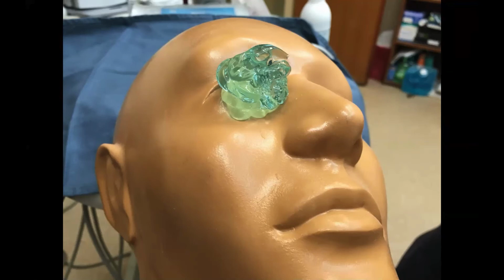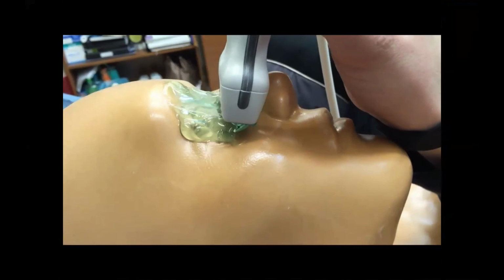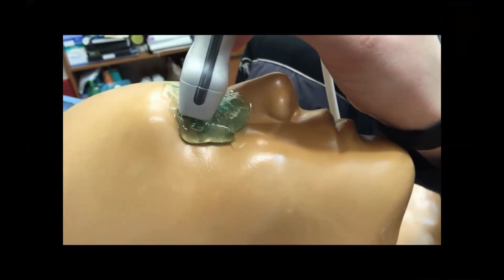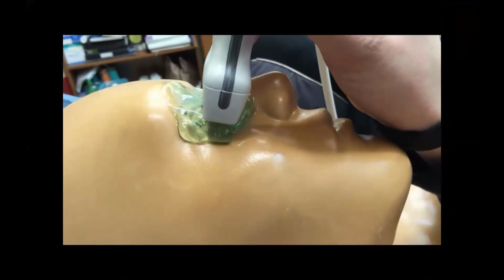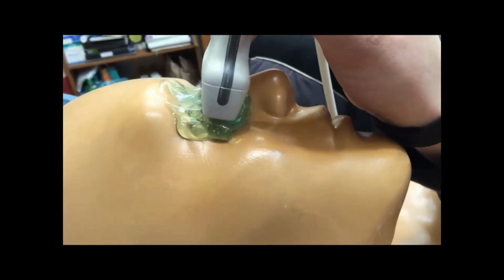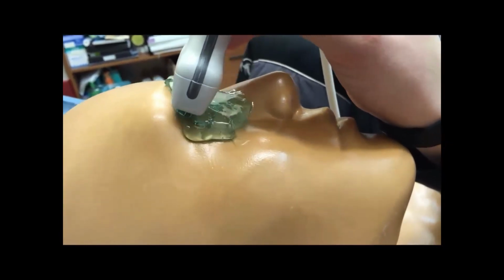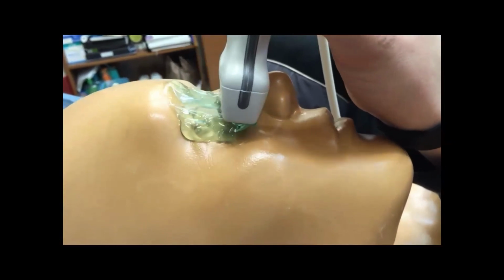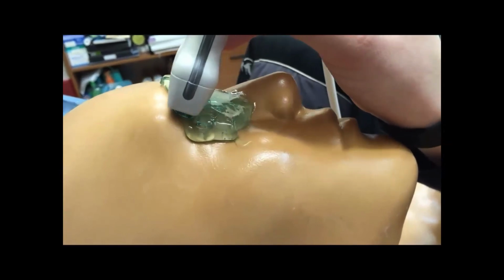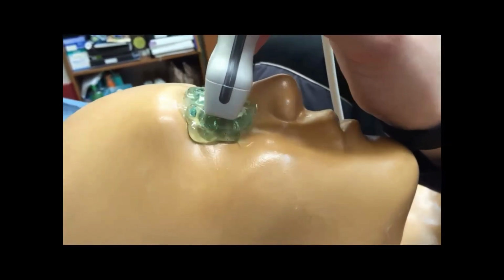Now, as you're scanning in either transverse or sagittal orientation, you're going to want to sweep through the entire eye. This is the benefit of ultrasound, that we can look in a very comprehensive manner throughout the entire eye, as well as, what we'll see in just a minute, have them move their eye. So in sagittal orientation, you put it down, you find your landmarks, and you sweep from side to side the whole way. And then same thing in transverse, sweep up and down so you can view the whole limits of that eye, just like you would do with a bladder when you're doing a FAST exam or a bladder volume. Just scan that whole area of concern, because what you may find is some of these pathologies may be subtle.